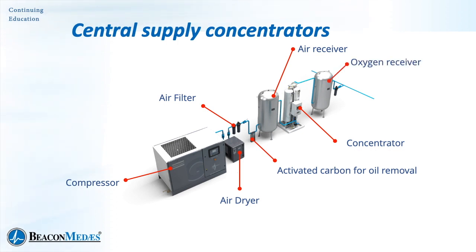That resulting gas will go into an oxygen receiver through an oxygen filter and into the system. And this is often referred to as the oxygen train, and you can see why. Basically, one component follows another, and the ultimate output is oxygen 93.